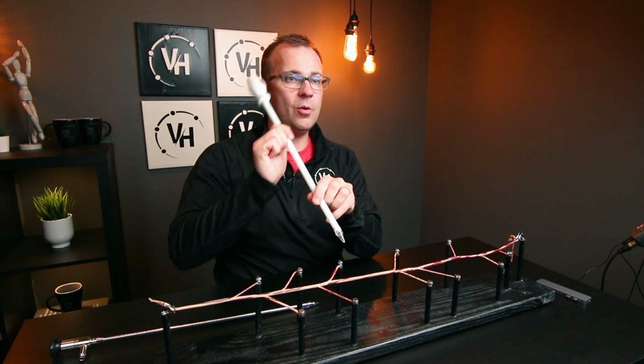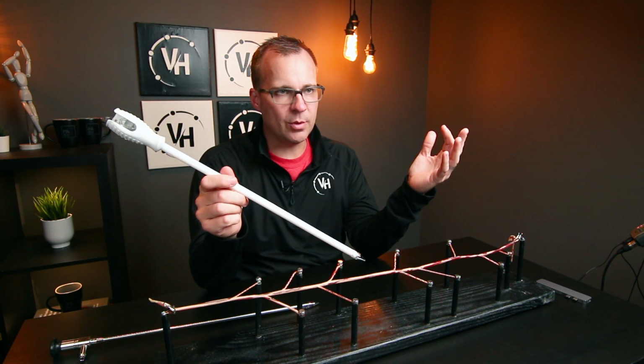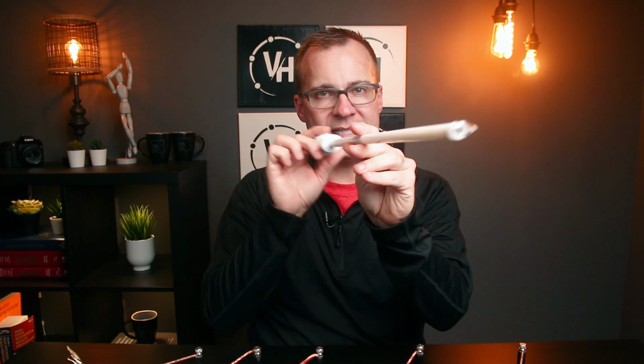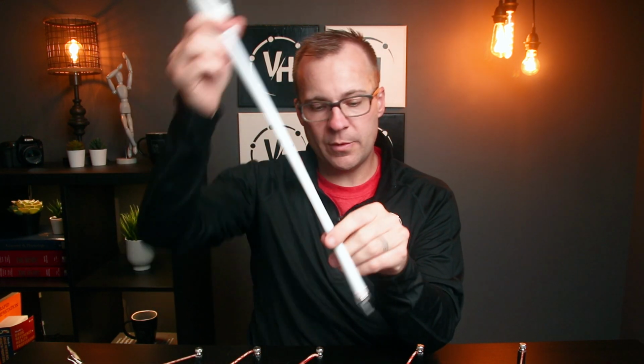So I can move the scope towards myself, away from myself, but as soon as I start doing this, that just has exponentially multiplied the number of places that saphenous can be. If I'm coming right at the camera, you can imagine how if I'm trying to hit the camera, if I am poking in the same plane, eventually I'm going to hit the camera, right? But if I'm going all over the place, boy, there's a number of places that I can stab at before I'm actually going to get right into the lens of the camera. So that's why we want to stay right here.